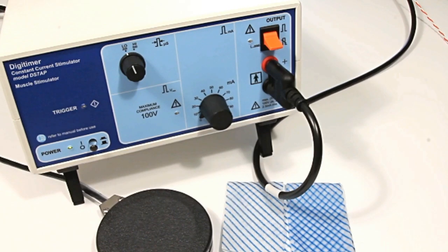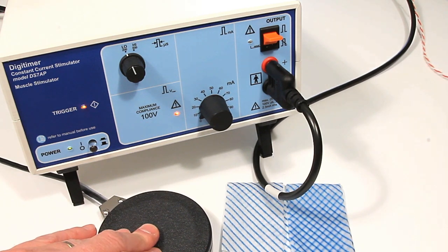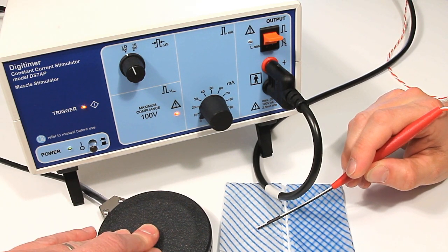In order for the DS7AP to deliver effective stimulation to the patient, it is necessary for current to pass between the two probe tips and activate any underlying musculature. In a surgery, a low resistance electrical pathway is desirable and this is achieved through copious swabbing of the skin with saline prior to commencing stimulation.